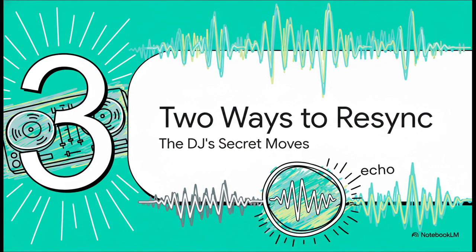So, if the signal disappears that fast, how does the MRI get anything useful, right? Well, this is where our DJ gets clever. He's got a couple of secret techniques up his sleeve to get that whole crowd back on beat and create a new, clean, measurable signal. And that signal is called an echo.